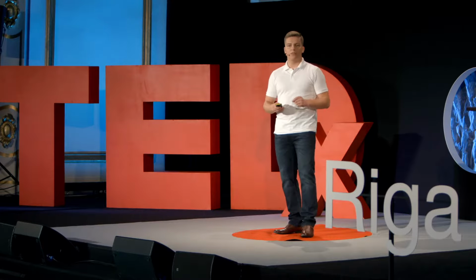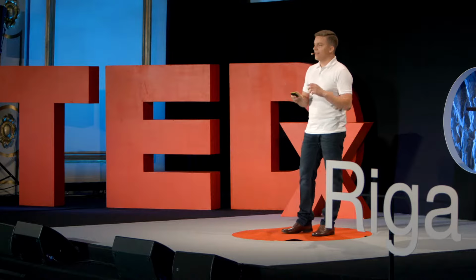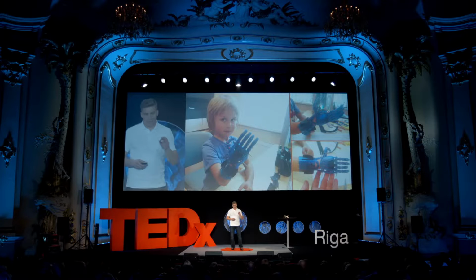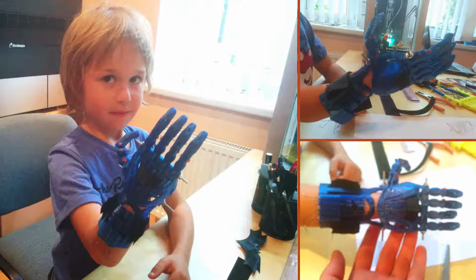One of the first problems that we encountered was that it's almost impossible to scale down the prosthesis to a size that would fit the boy. When we got the limb right, the palm was too big, the fingers were too long, and so on. To get to the first assembled prototype, it took us several scaling rounds, tens of 3D prints, and at the first fitting, the prosthesis was so off, I felt ashamed.